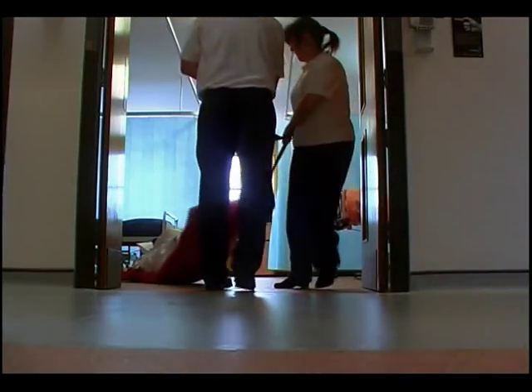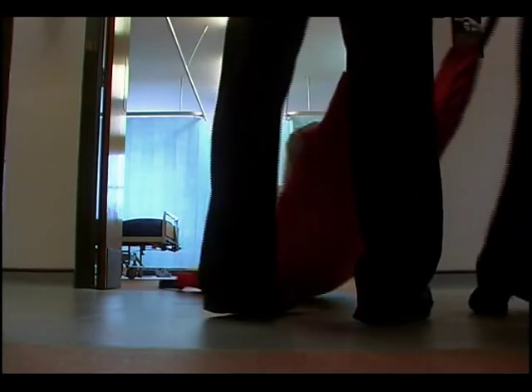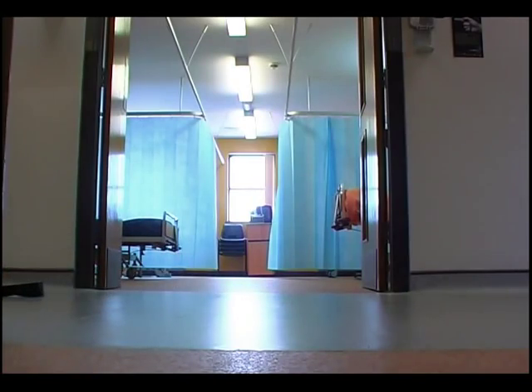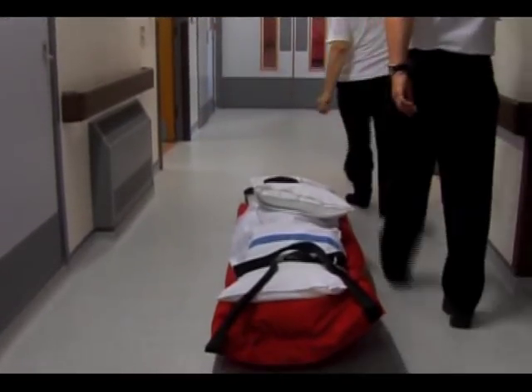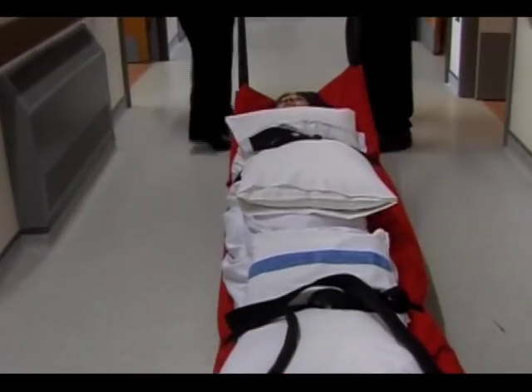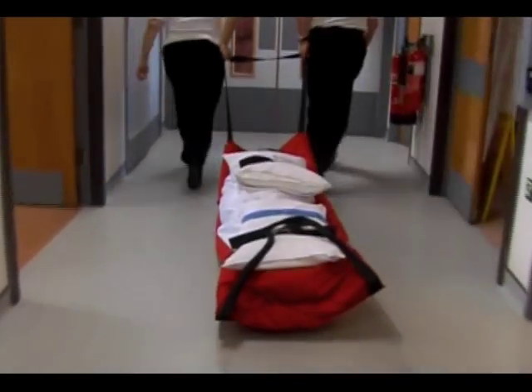The ski pad is manufactured for some customers with a third strap in the middle for extra security and to give additional buckling options, particularly where the evacuation of smaller people is concerned. A mini ski pad has also been produced for use in schools, and it is approximately 30 centimetres shorter in length than the standard ski pad.